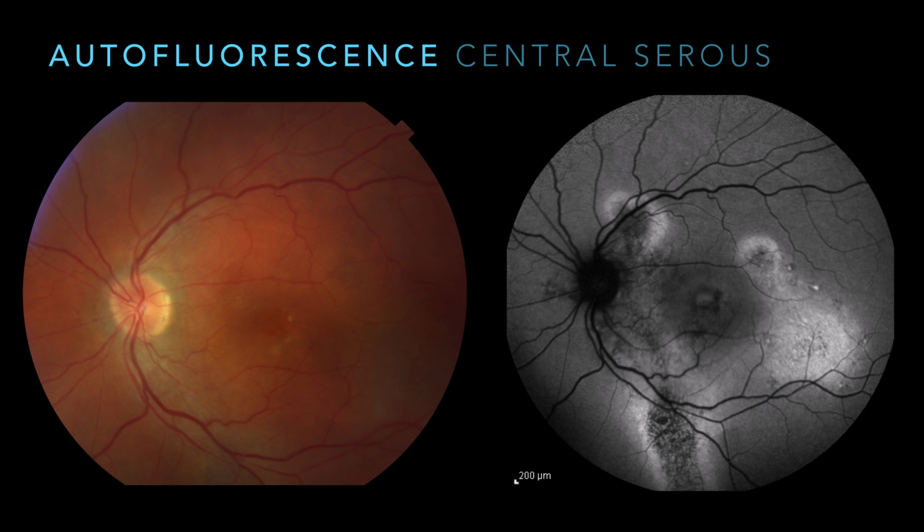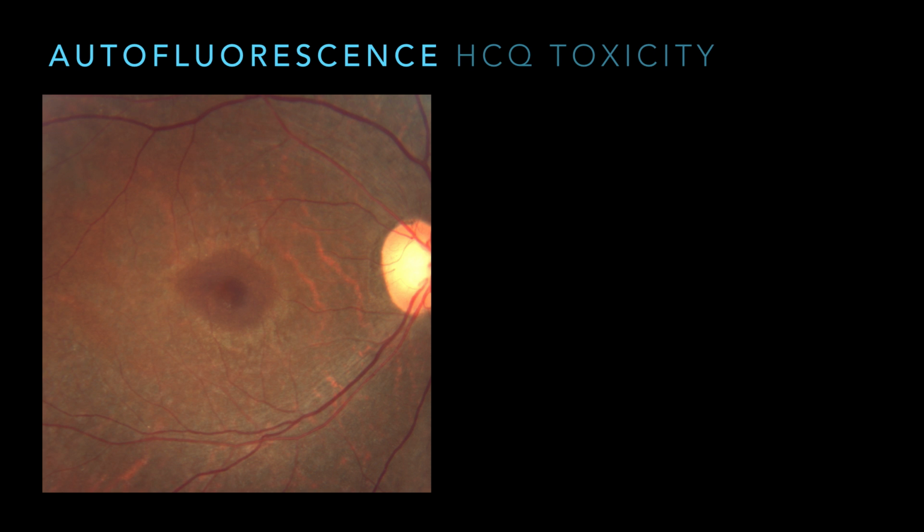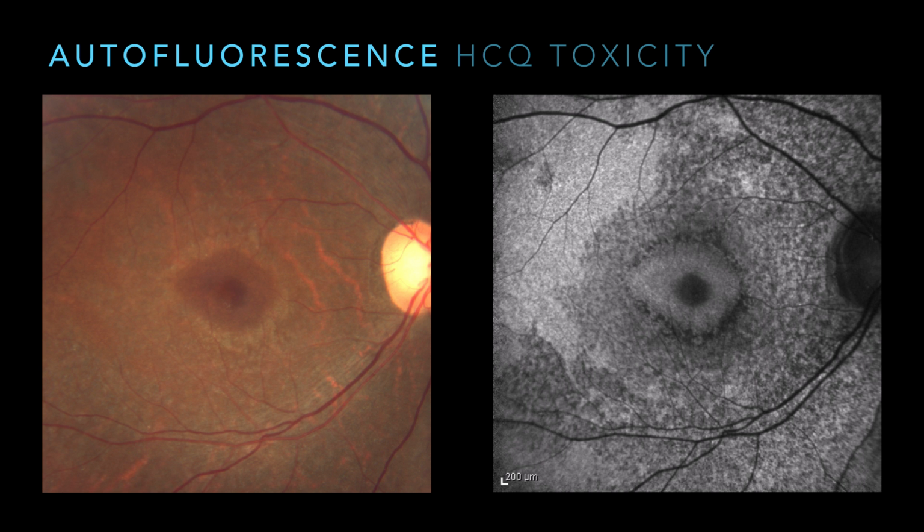Of course, a choroidal hemangioma or some choroidal nevi with CNV can also do this, but again, it helps confirm the diagnosis, and it makes it really obvious, and that's a recurring theme with autofluorescence. This is a patient on hydroxychloroquine. She's got a bullseye maculopathy. This just really slaps you in the face with the diagnostics. I mean, you can't ignore this diagnosis now.